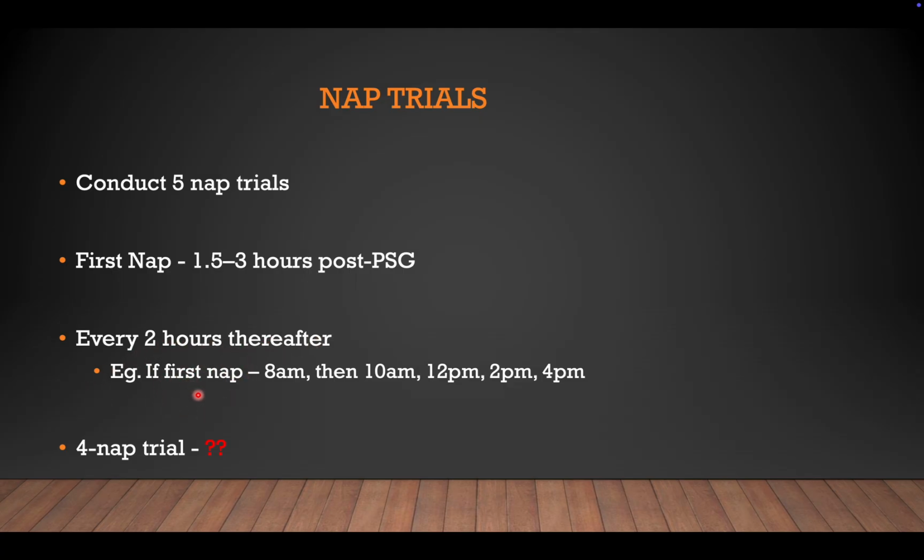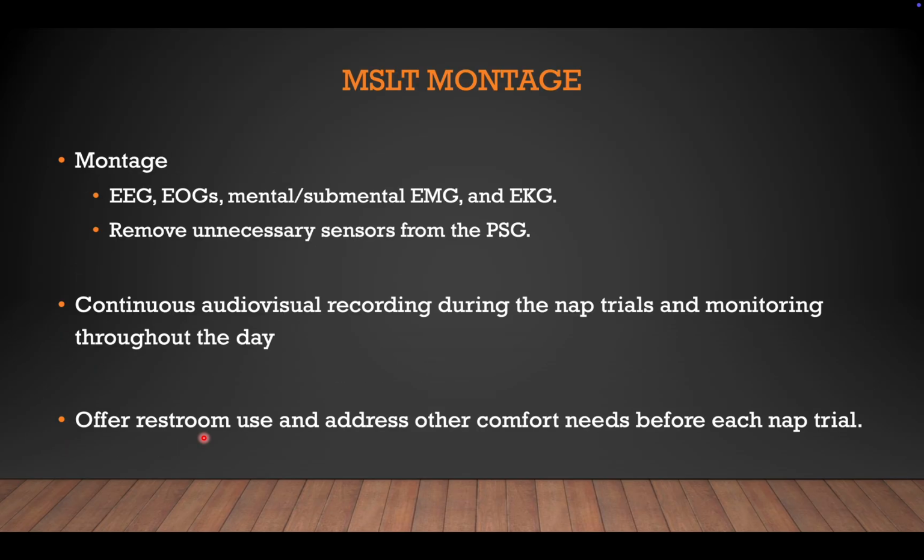For example, if the first nap started at 8 a.m., then the next naps would be at 10, 12 p.m., 2 p.m., and 4 p.m., and that's it. There can be a 4-nap trial, or the shortened version of the MSLT can be done, which we'll be discussing down the road. So now the question is, what is the MSLT montage required?